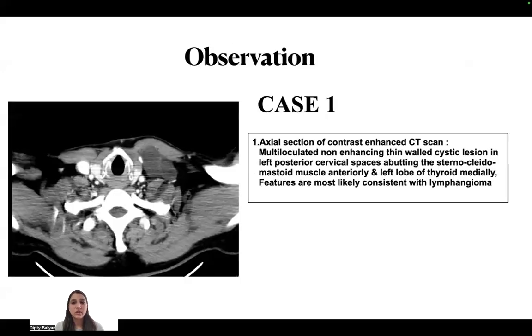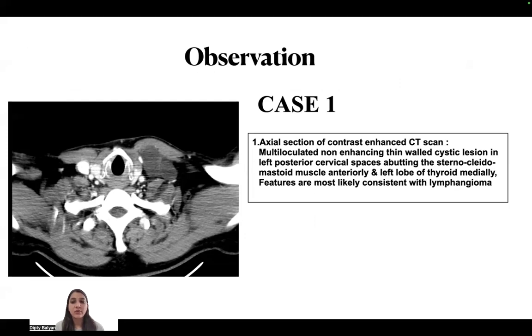In the first case, the axial CT scan image shows a multiloculated non-enhancing thin-walled cystic lesion in the left posterior cervical space, abutting the sternocleidomastoid muscle anteriorly and the left lobe of thyroid medially. Features are most likely consistent with lymphangioma.